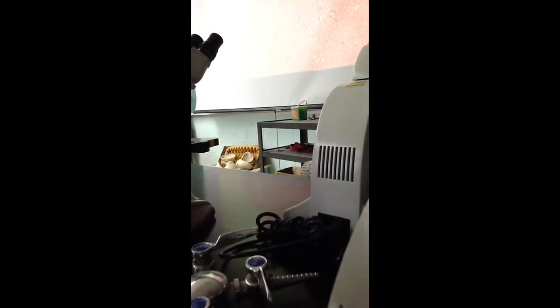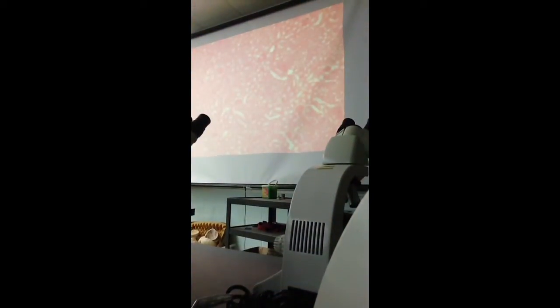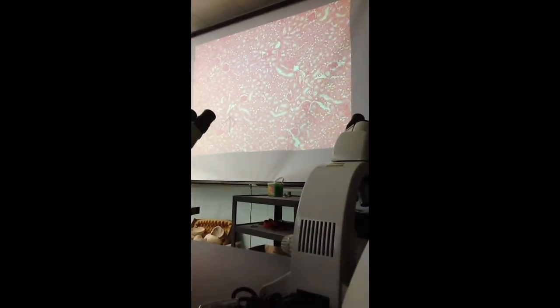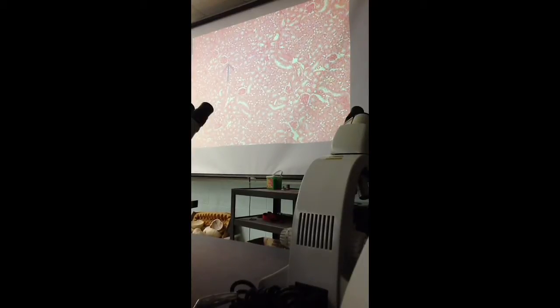Not clear, but the outer layer will have the renal capsule. Let's focus on this field of view. You are able to see these dots. What structure is this?